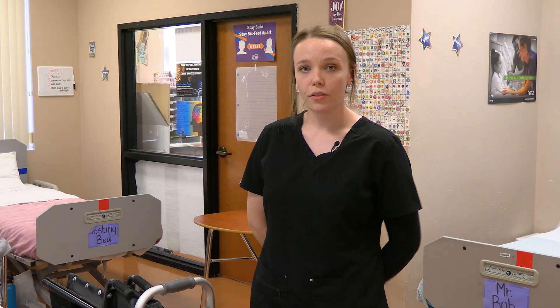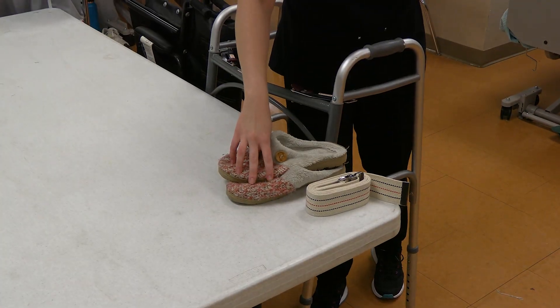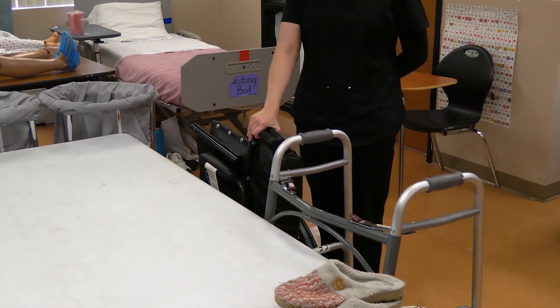The supplies you will need for this skill are a gait belt, a pair of slippers, a walker, and a wheelchair.